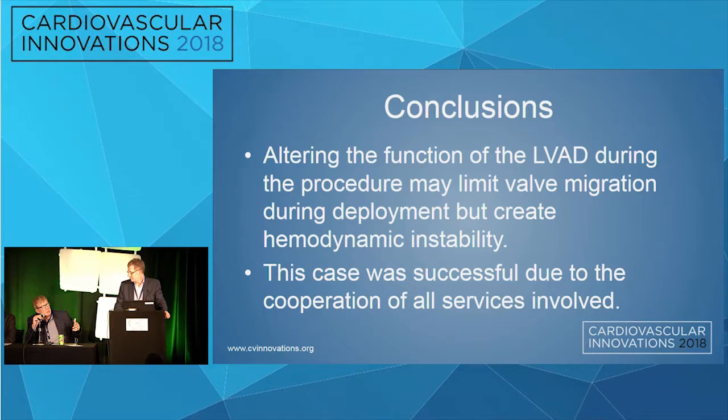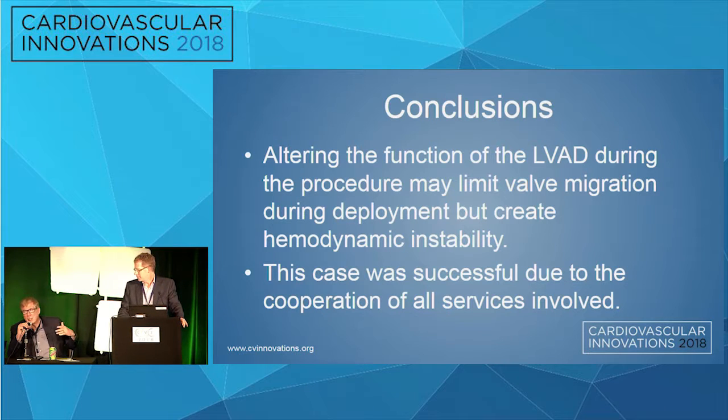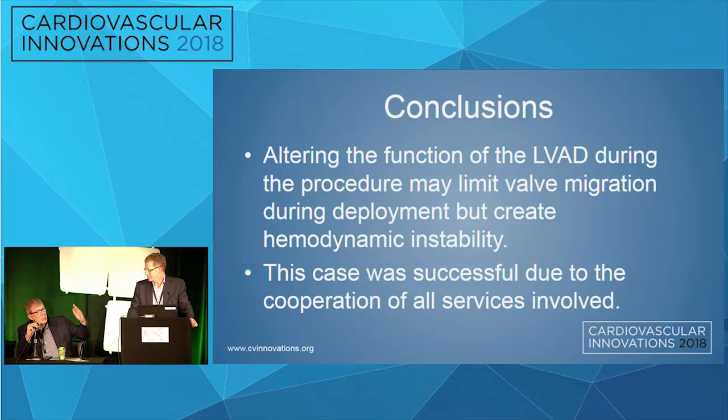The other thing that we've sometimes done with these AR cases is actually pace fast, almost pace like Sapien pacing when we're trying to deploy it, just to make sure that it stays in place. Because you've outlined the fact that if you go slower with that and you're not in the right place, it's actually going to the ventricle.